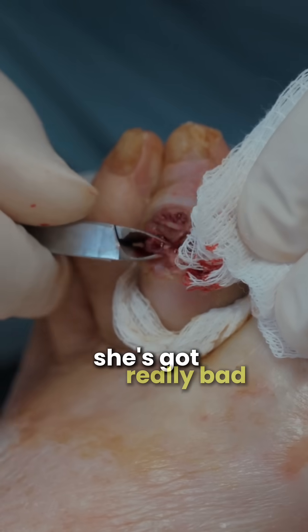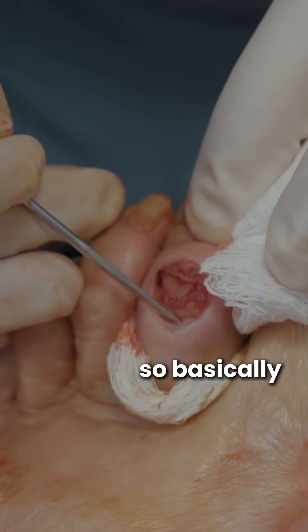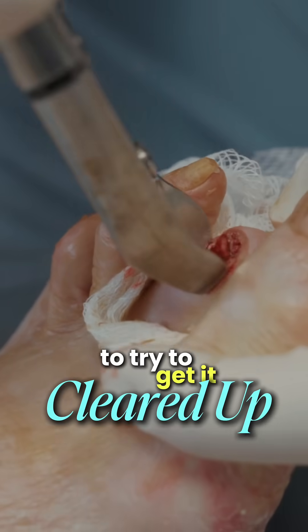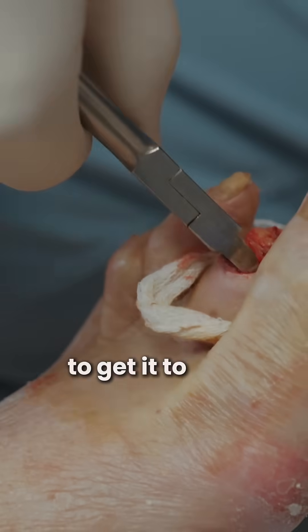This is a patient with really bad arterial disease who developed this wound over the last month, and the bone is actually right underneath it. Basically what we're planning on doing — the least aggressive option for her — is to clean this up, cut some of the bone out, and try to put some retention stitches along it to get it to heal up.